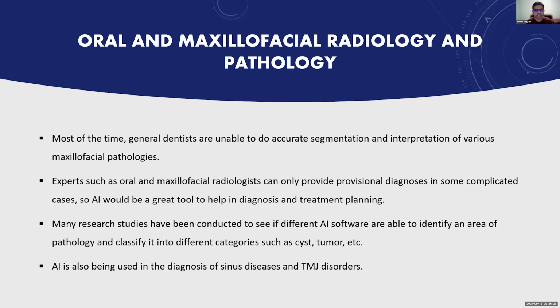In the case of pathology, it is impacting any pathology you see in our dentistry, whether it is cystic lesions, tumors, TMJ disorder, sinus pathology, day-to-day general dentistry pathology. It is diagnosing and also giving a treatment plan for those. Some of the models are FDA approved, so you can use them. Some of them are under research, so they will be available when they get FDA approved. But basically, the AI foundation is mainly based on the diagnosis of the imaging as of now.